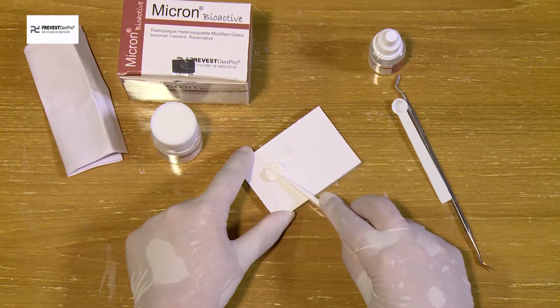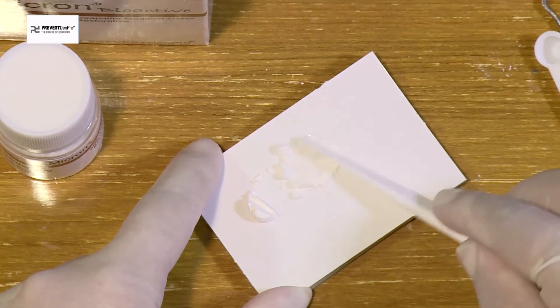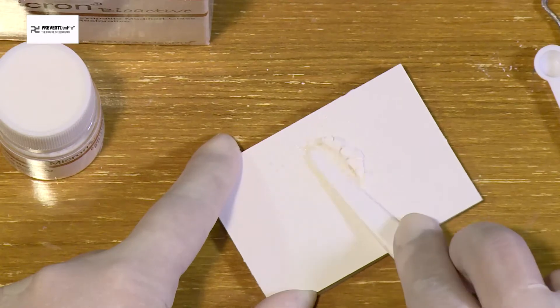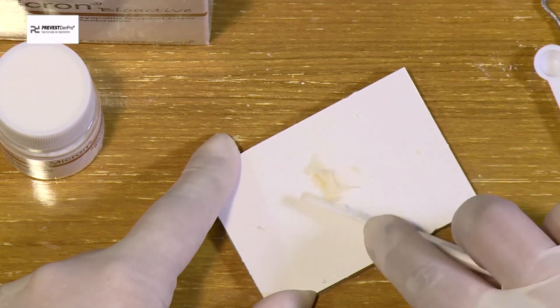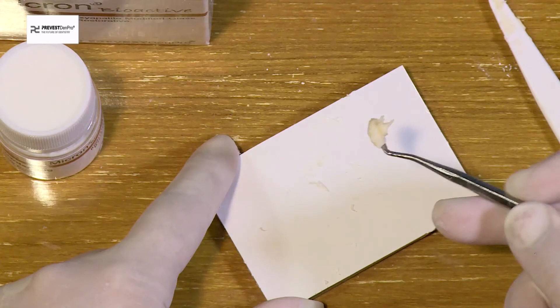Divide the powder into two equal parts. Mix the first portion with the liquid, then incorporate the remaining portion and knead it in a folding motion to achieve a putty consistency.